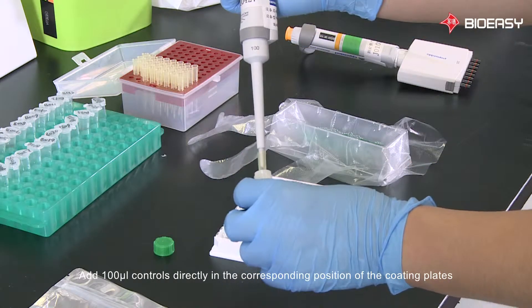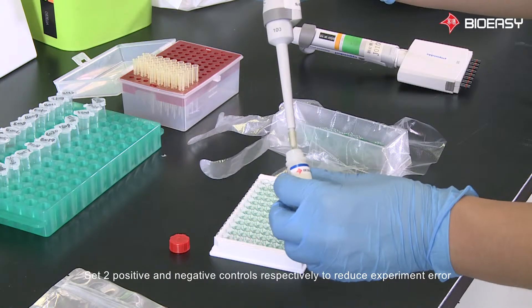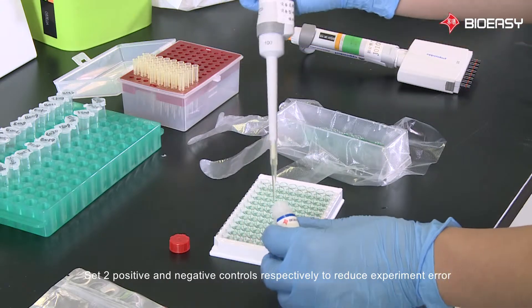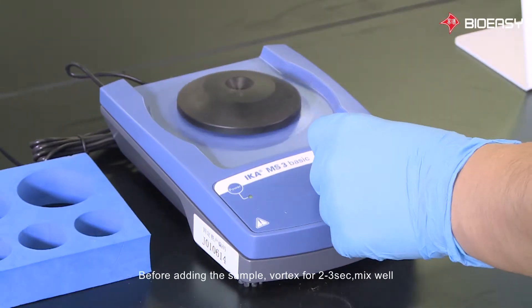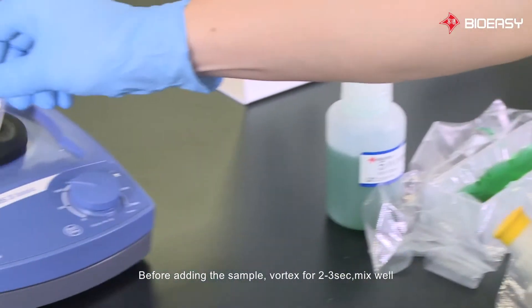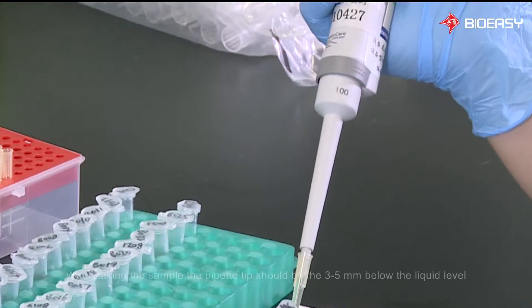Add 100 microliters of controls directly in the corresponding positions of the coated plate, setting positive and negative controls respectively. To reduce experiment error, vortex for 2 to 3 seconds and mix well before adding the sample.